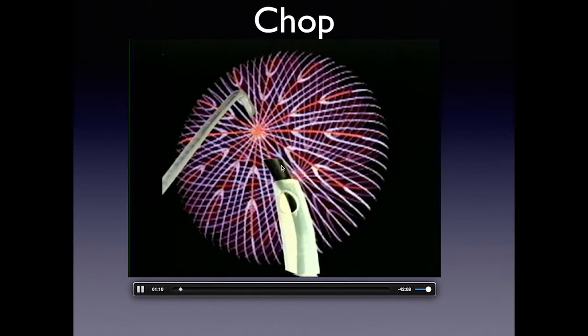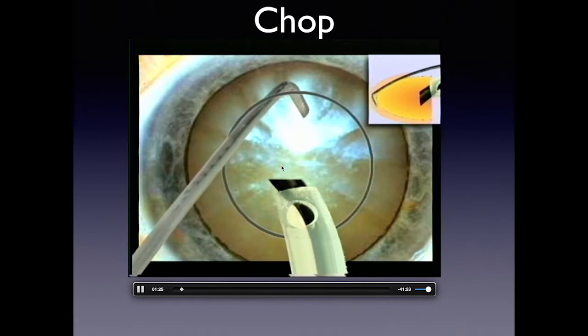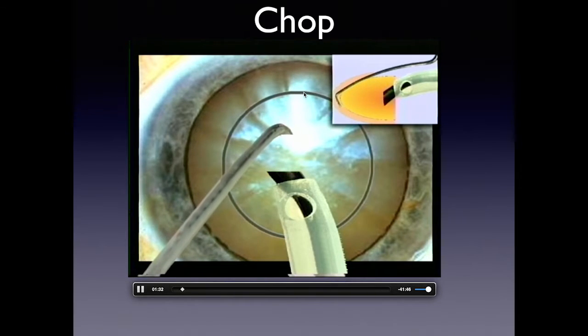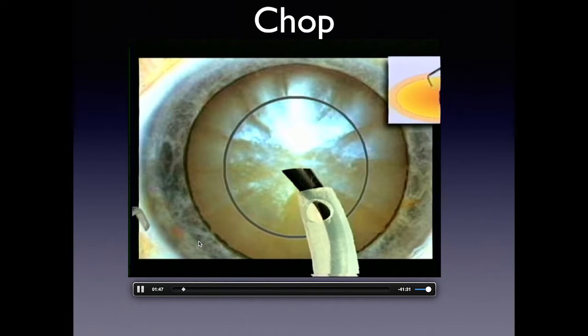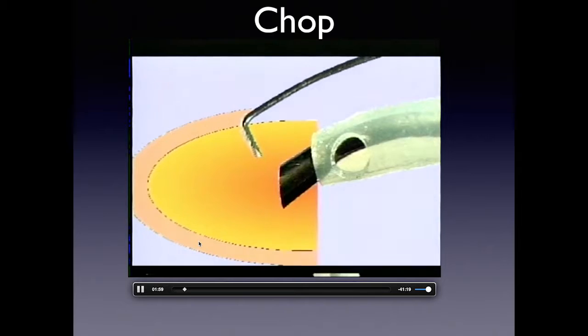In this cartoon version, the second instrument comes in for a horizontal crack: occlusion, no movement, and the non-dominant hand comes toward the tip and moves to the side. The vertical chopping version — which I like — means going down through the nucleus inside the capsulorhexis, which I feel is slightly safer than horizontal. It's important to understand both techniques and what foot positions you want to be in. We then demonstrate a Miyake view with a horizontal chop: the handpiece goes out, we're not occluded, then we bury it into the nuclear chip. The chopper is brought to the tip while the dominant hand stays stable and the non-dominant hand does most of the work.